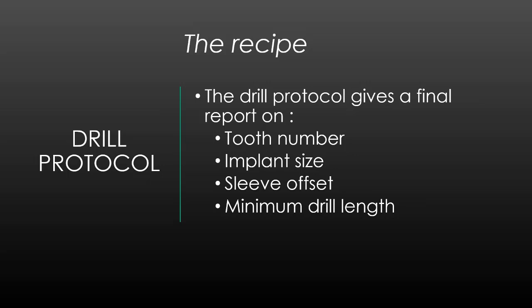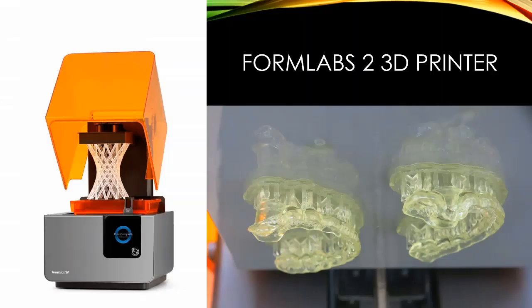And so again, we call that drill protocol the recipe. It gives you your final report on many of these factors. So before the patient ever sets foot in the office for surgery, we already know what implant we're using, what the drill sequence is going to be. That's all been figured out. So once that design is complete, we send that over to our 3D printer.